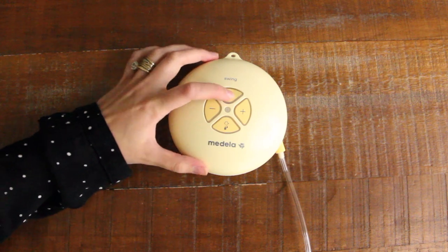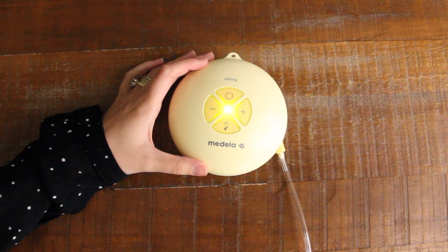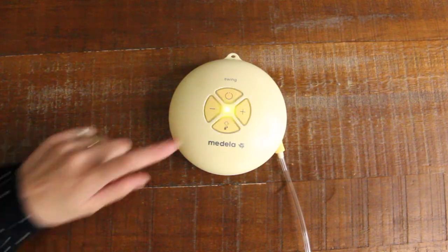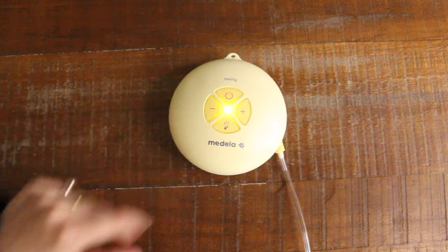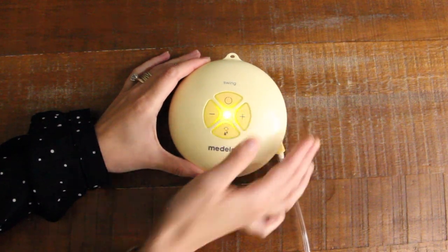The Medela Swing, like most all other Medela pumps, has a two-phase expression technology. Once you power it on, it will automatically start in stimulation mode, which is a fast rhythmic suction to help get your milk flowing. This will run for two minutes, and then it will automatically switch into expression mode, which is a slower rhythmic suction once your milk has started flowing. If you find you reach let down before the two minutes are up, no problem — you can click the expression button at any time, which will automatically switch you over to that slower speed, and you have full control over the speed throughout the whole process with the up and down buttons.